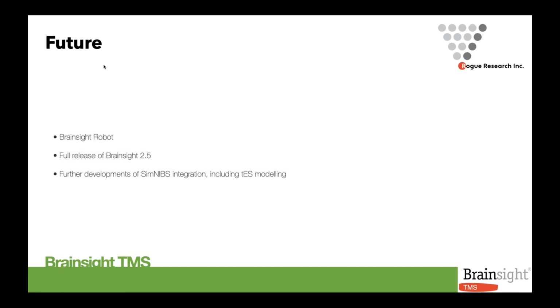And then with that, we'll see further developments of the SimNIBS integration, with the inclusion of TES modeling. One important point on Brainsight then, we already know that Apple have released their new macOS Big Sur. If you are a Brainsight user, it's vitally important that on the Brainsight Mac, you don't yet update to Big Sur. There's something in there that Apple have done, which means that one of the internal drivers renders that Polaris Vicra obsolete. It won't work if you update.